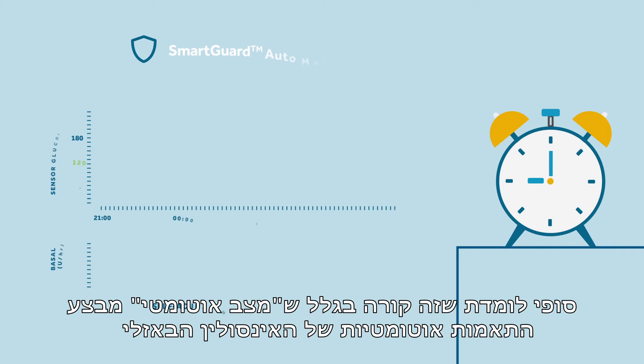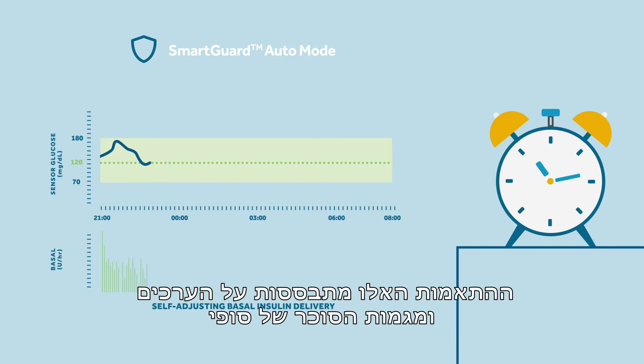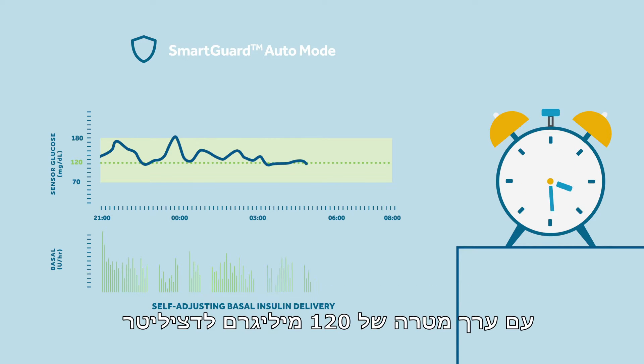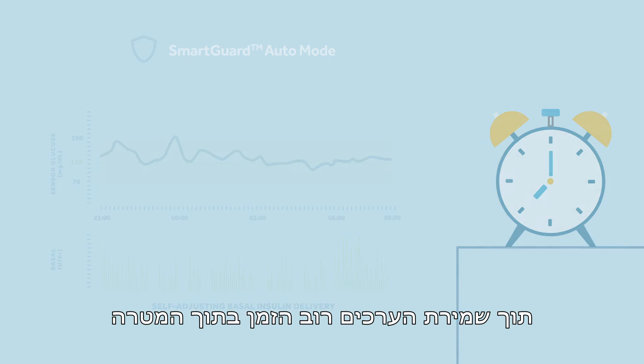Sophie learns that this is because auto mode provides automatic basal adjustments known as auto basal every five minutes. These adjustments are based on Sophie's glucose values and trends with a target value of 120 milligrams per deciliter. This has been chosen to support the goal of the lowest risk of hypos, whilst keeping most time in range.